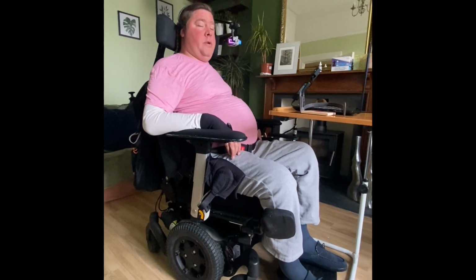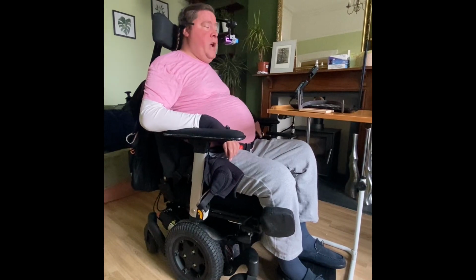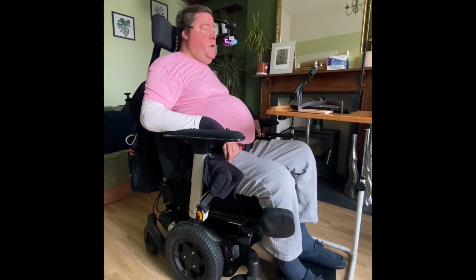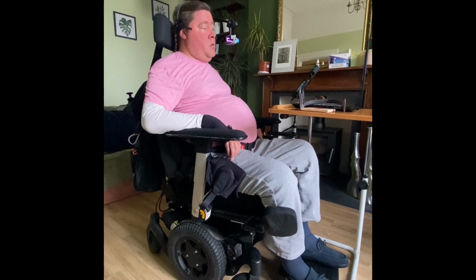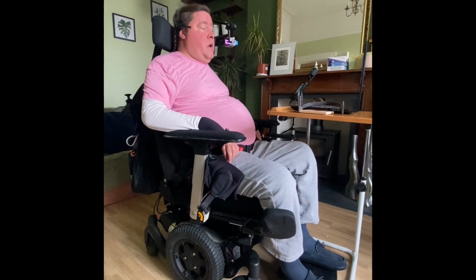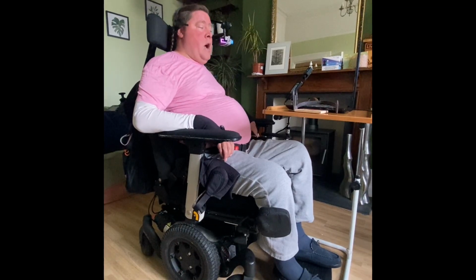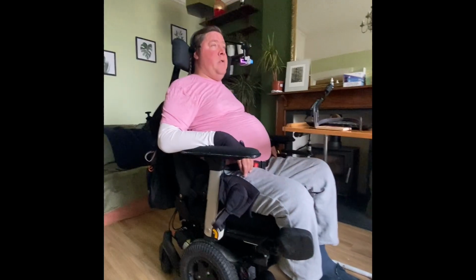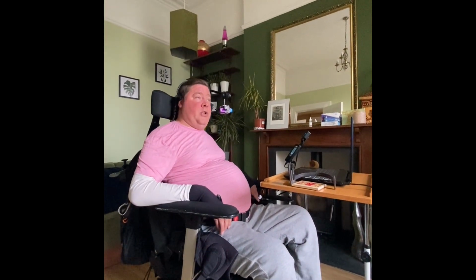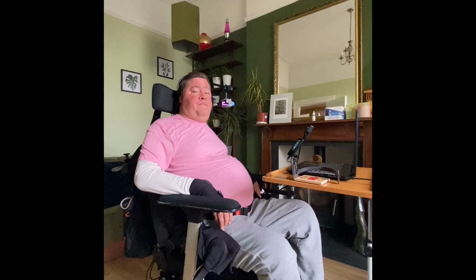Hello, my name is Richard Fowler. I'm the designer of the autonomous aerial mobility platform for quadriplegic users. It's a multimodal head control and a Boid swarm simulation system, allowing quadriplegics to navigate a 3D space as intuitively and easily as possible.